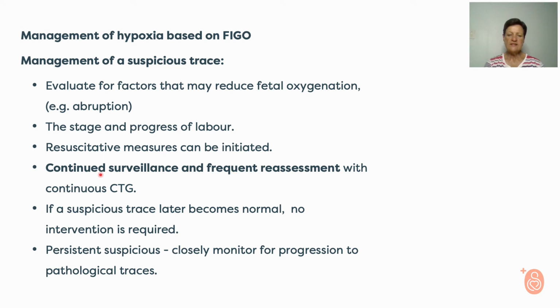So the moment that something is abnormal or suspicious, the fetal heart rate should continuously be measured so that one can see whether there is any reaction to the resuscitative measures or not, and that will also influence the decisions that are being taken.